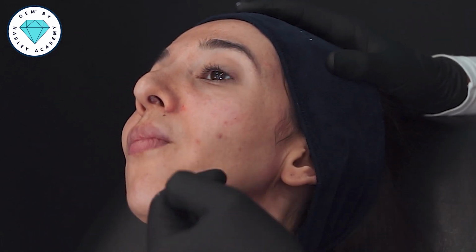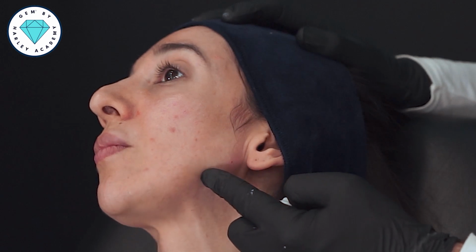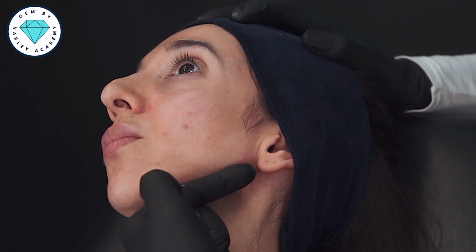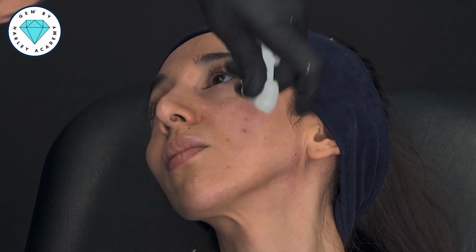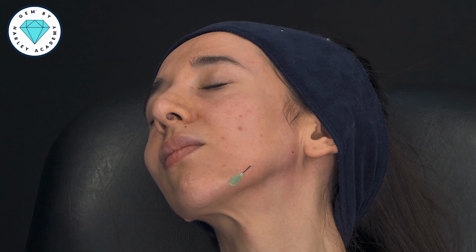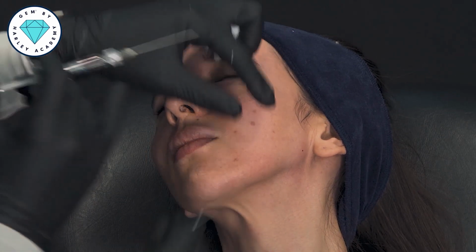Now we're going to move to some subcutaneous shaping. And if you turn this way a little, I can see a little way in which the jawline goes inwards and then back outwards. And my objective now is to try and continue the jawline directly straight all the way through to this nice new projected corner of the jaw. So I'm going to move with an access point just here. And so then the second half of my product can be used in layer 2.